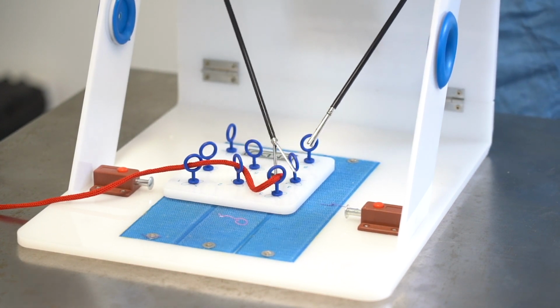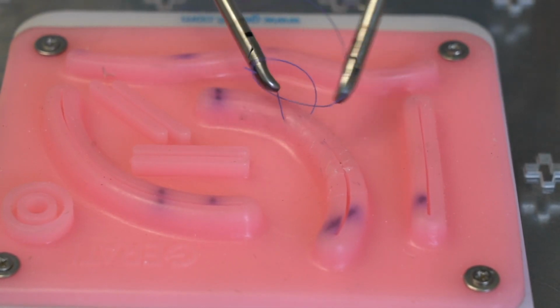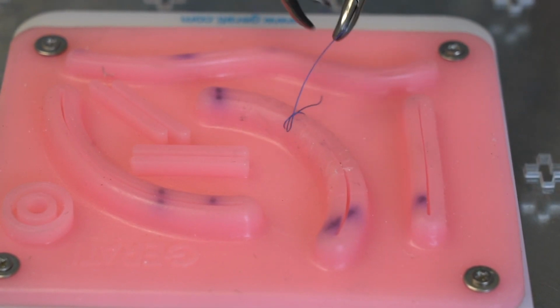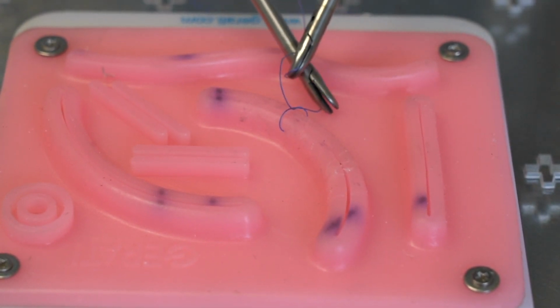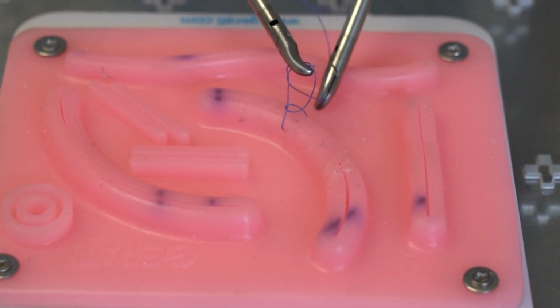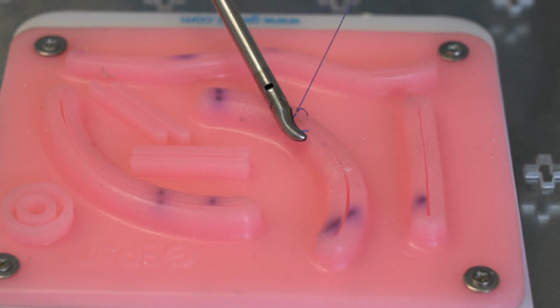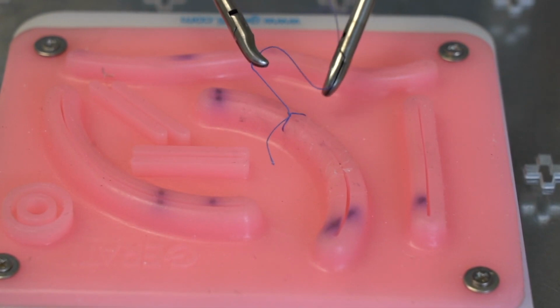But with practice, you can see that we can get some pretty significant skill performing things like knot tying and even suturing, although these are very advanced procedures that will take you a while to get comfortable with doing. There are lots of videos on YouTube that can be really helpful in seeing what's possible with laparoscopic surgery, as well as practice techniques in order to improve your skills.